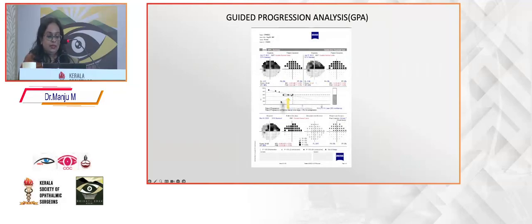Almost the same, and there is one more thing. If you change your management protocol, or if you do some trabeculectomy, or other glaucoma surgeries or laser procedures, you need to change the baseline field after that.